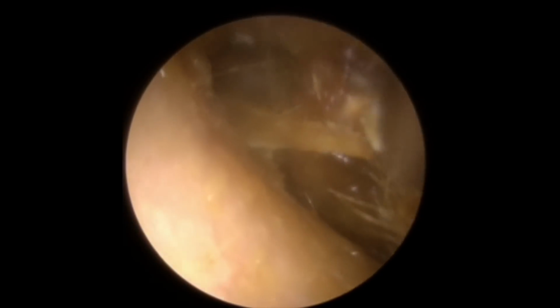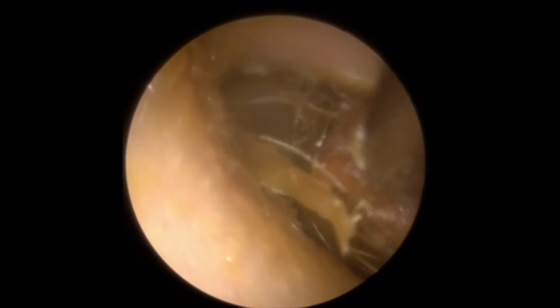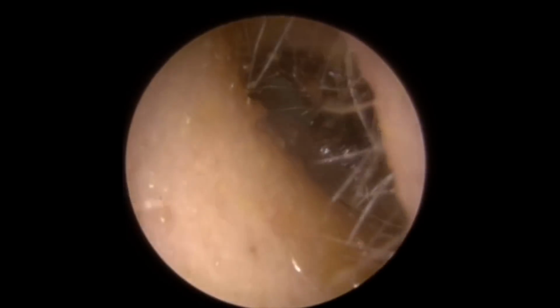So just rolling this piece of wax now down the canal, trying to get it out of this entrance here. You can see we're starting to get to the back section, lifting up. There we go, out he comes around the corner. You can see a long, thin section of wax there. A little bit broke off in the entrance, so we'll get rid of that piece next.